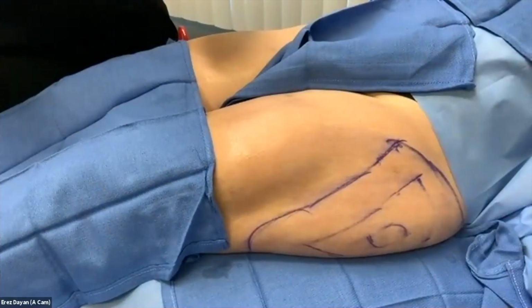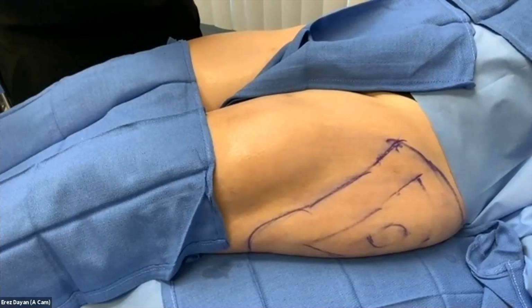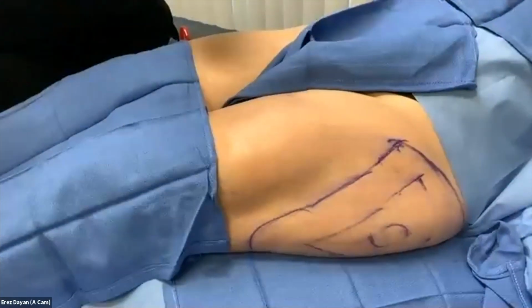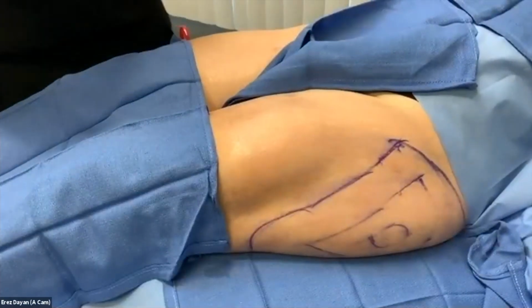So what we're going to do is actually a body case with the face-tight handpiece. The reason I'm using the face-tight handpiece is because it's a rather short area, so I think it's a nice application. The face-tight handpiece is probably the most versatile handpiece because it's not too long, not too short. It's right in the middle, so you can use it on body areas. And I think it's good to see that.